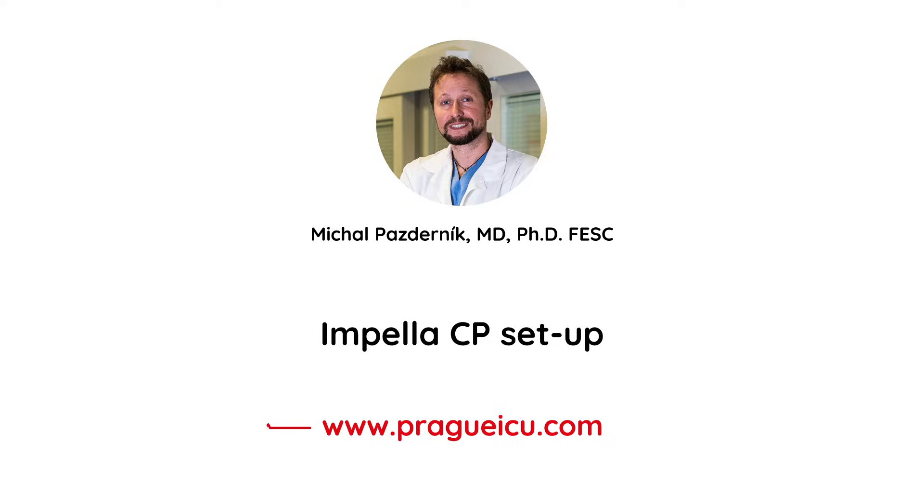Hi guys, welcome back to Prague ICU. Today we are going to demonstrate how to set up components for the Impella CP and how to transfer the initial setup configuration of the Impella CP to the standard configuration.